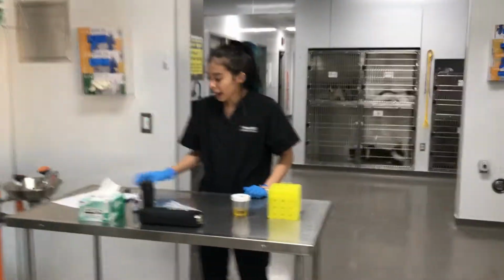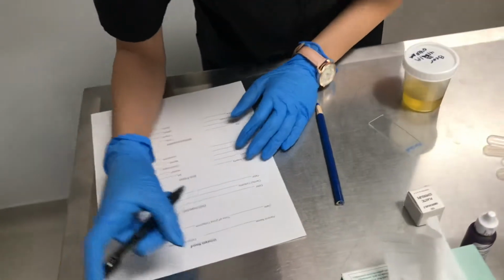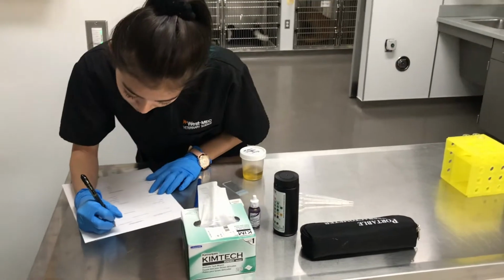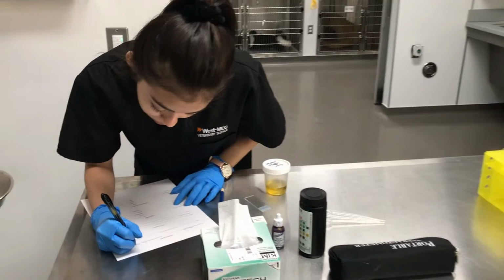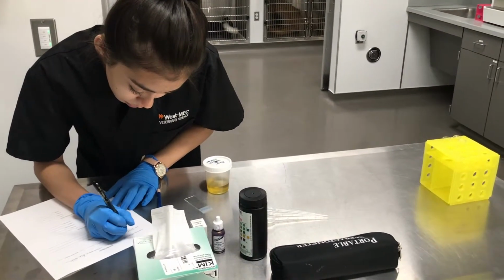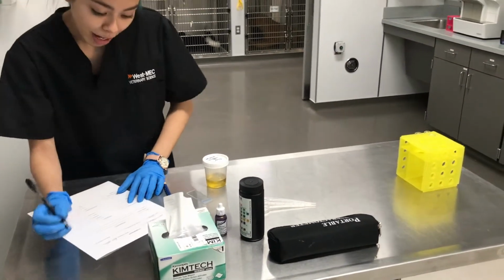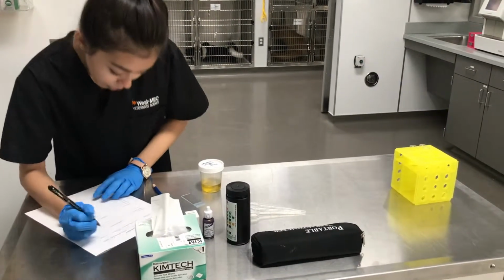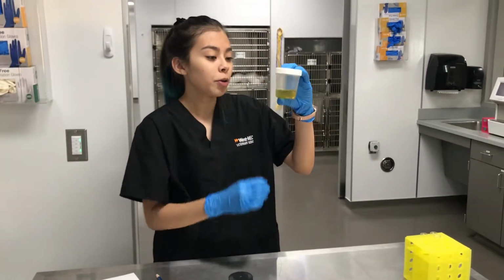So I'm going to start off by writing the patient's name on the urinalysis record. And I'll also be writing the method of collection of the urine and today's date, and the time of urine collection. And when I'm done with that, I will start a visual inspection of the urine sample.